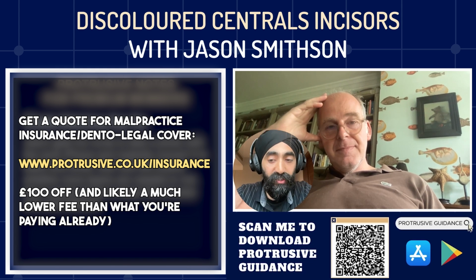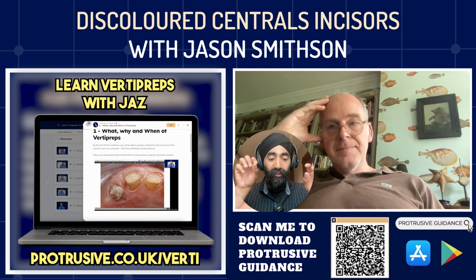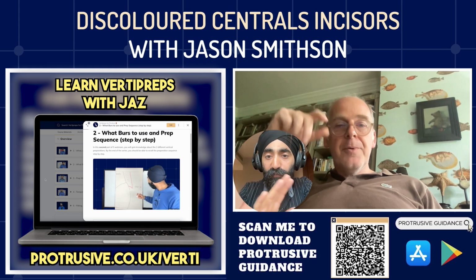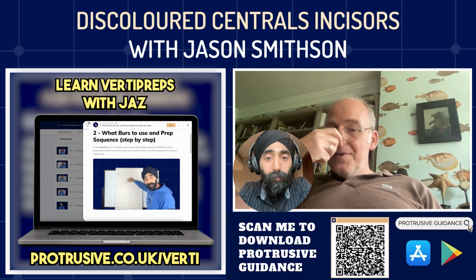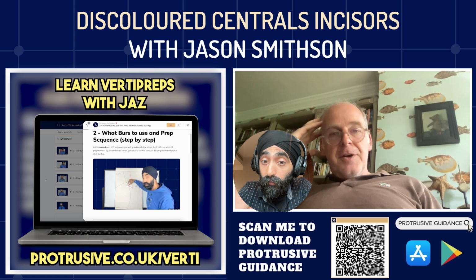Brilliant. So there we have it, guys. Next time you're thinking, have you got enough flowable opaquer on, or doing the composite button test at the beginning, use a black and white photo to check if you've got the value there or thereabouts. A good kit. Yeah. Before we leave, a little take home about the composite buttons.